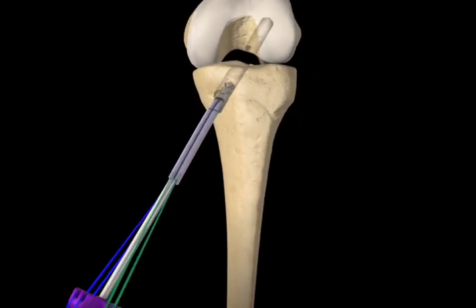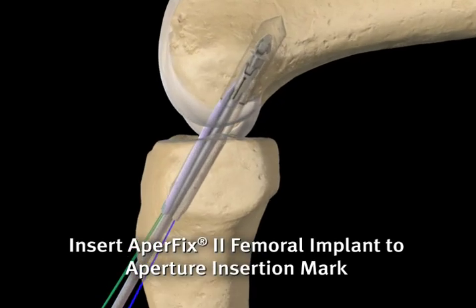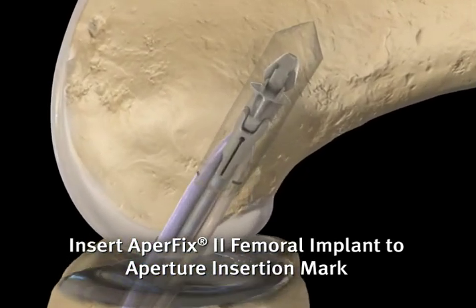Holding the inserter handle with the safety pin facing straight up, the implant is inserted through the tibial tunnel and into the femoral socket up to the graft marks.